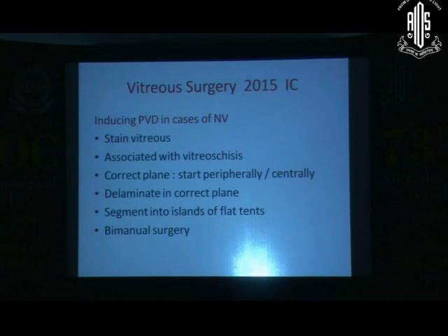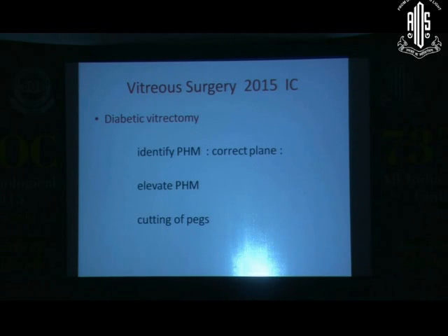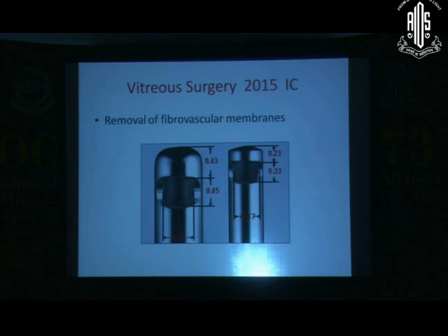Going on to inducing PVDs in cases of neovascularization, as Dr. Bhomaj has pointed out, we should never do this because it will pull out the vascular plugs and lead to severe bleeding. So we use different techniques when we address such an issue. We should remember that in addition to other neovascular pathologies, diabetes has an ischemic retina which is very thin in long-standing TRDs in some cases.